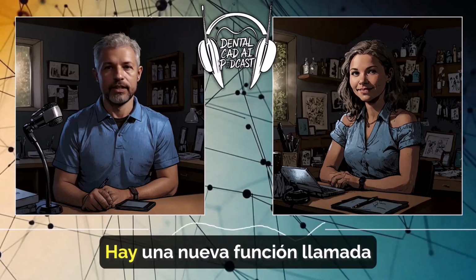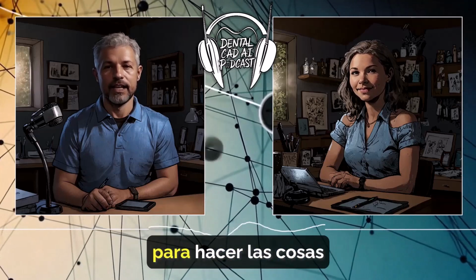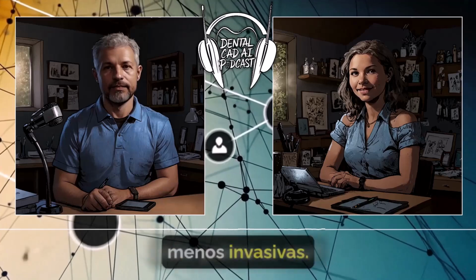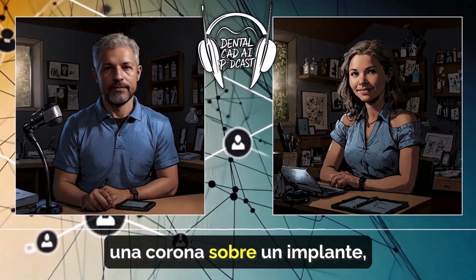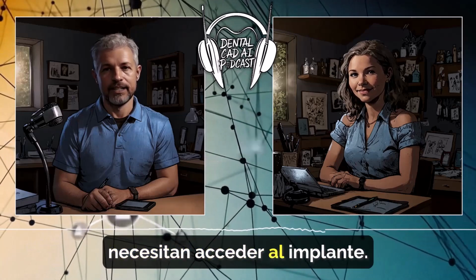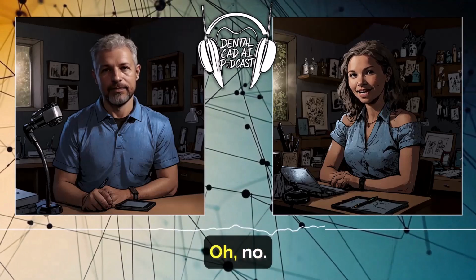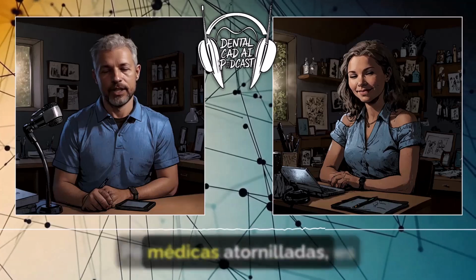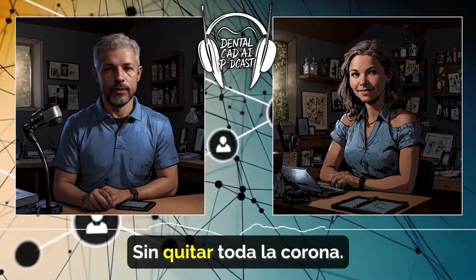It does actually. There's a new feature called screw-mentable restorations, and it's specifically designed to make things less invasive. Okay, how so? So imagine you get a crown placed on an implant, right? But later on there's an issue and they need to access the implant. Traditionally, they might have had to remove the entire crown. Oh, no. But with screw-mentable restorations, they can include a screw hole in the superstructure. So they can just access it directly. Exactly, without removing the whole crown.